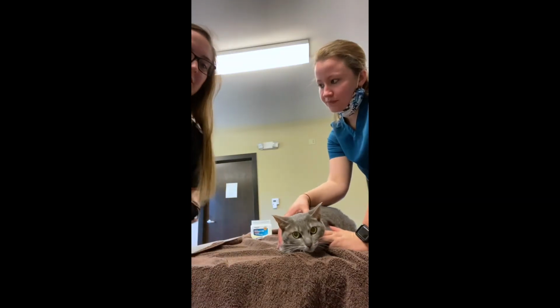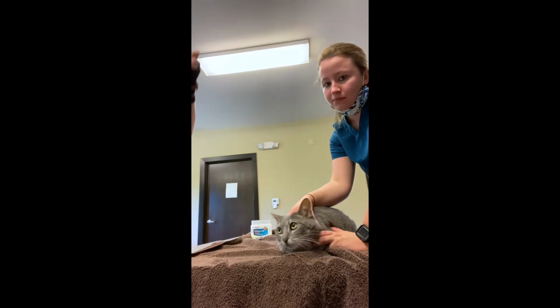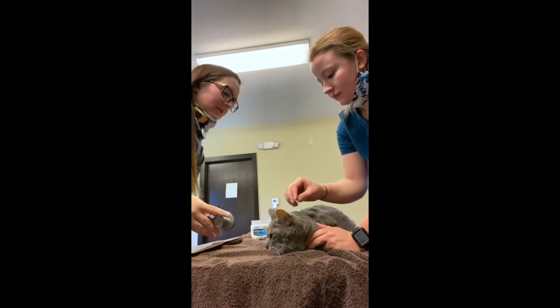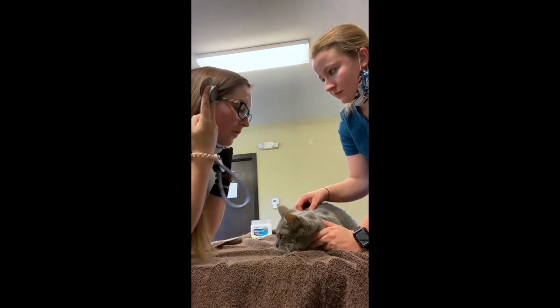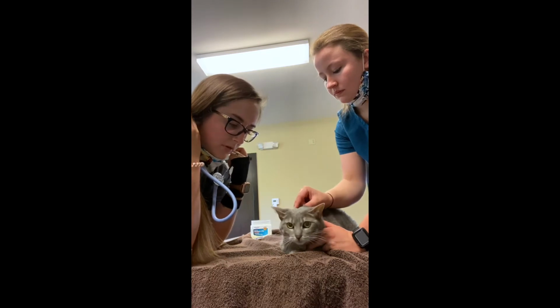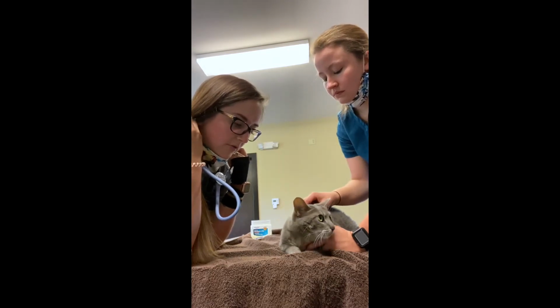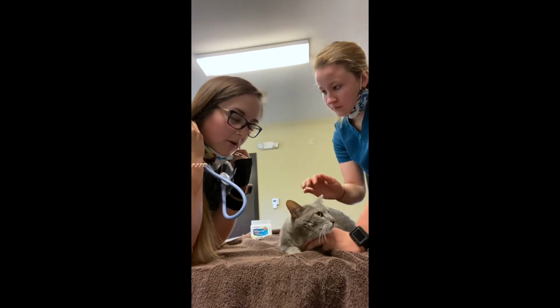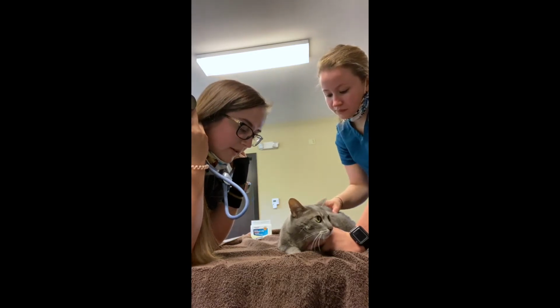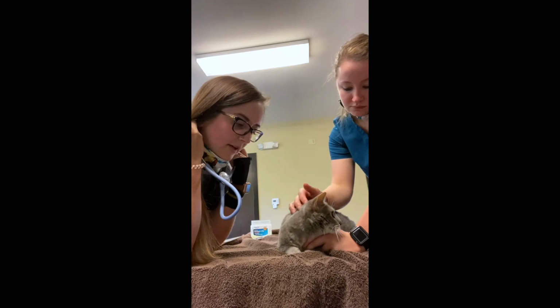All right, so we are going to do a TPR on this patient here before her surgery. We want to listen on both sides of her heart and listen to her lungs for any kind of wheezes or crackles, and her heart rate and rhythm for any kind of abnormalities, and then we'll get her temperature and assign her an ASA grade.